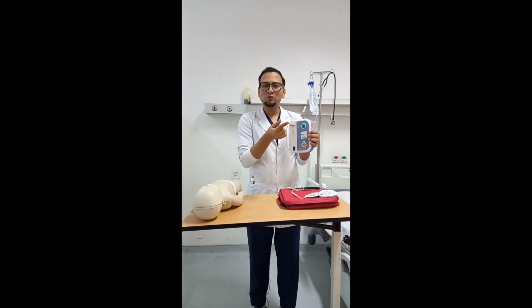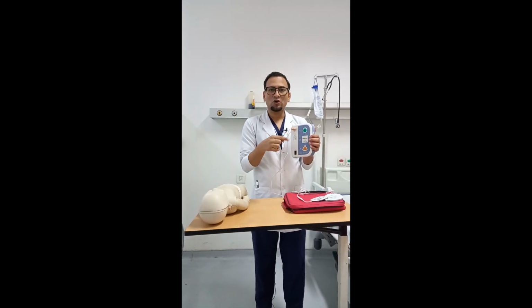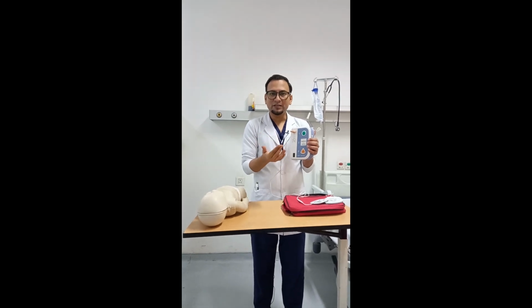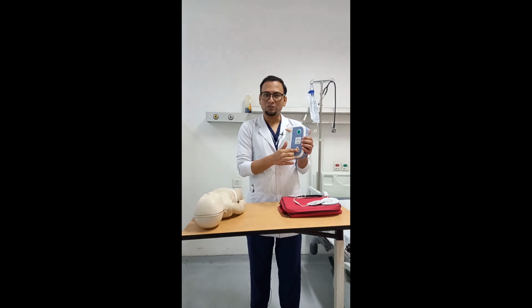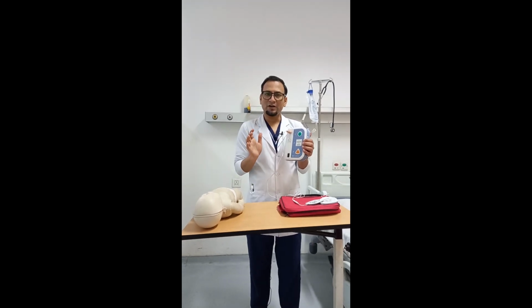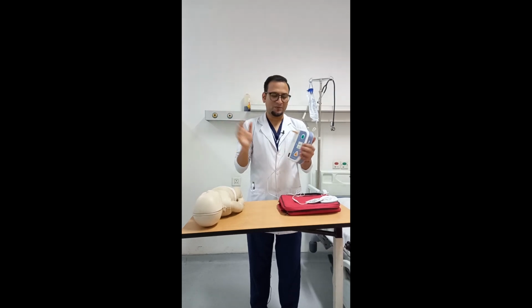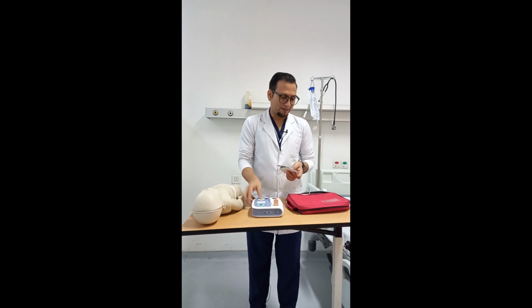Then the AED will give you a command: analyzing heart rhythm. Rhythm is analyzed, shock required. Then deliver the shock now. Charging, stay away from the patient, and press the orange button for the shock. Then we press the orange button, the shock will be delivered, and we can resume with CPR. Now I am going to show you how to apply the AED pads.